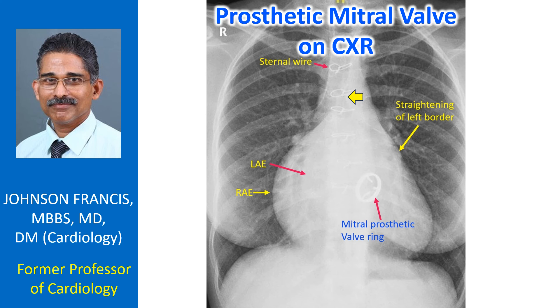The prosthetic valve can be identified as being in the mitral location by its position below the line joining the pulmonary bay to the right cardiophrenic angle. An aortic prosthetic valve will be above that line.